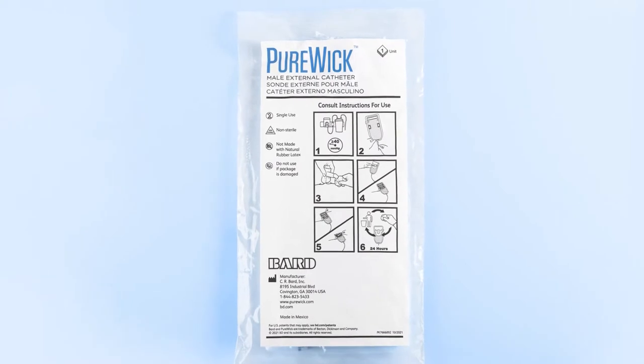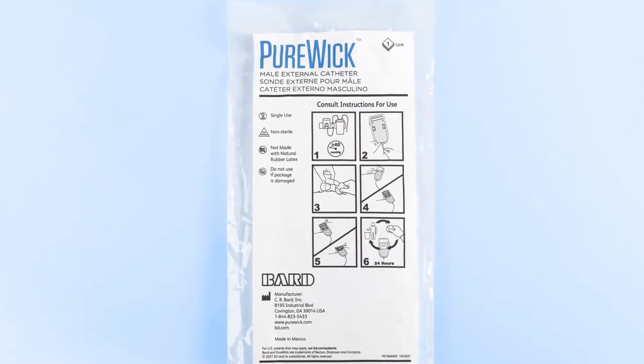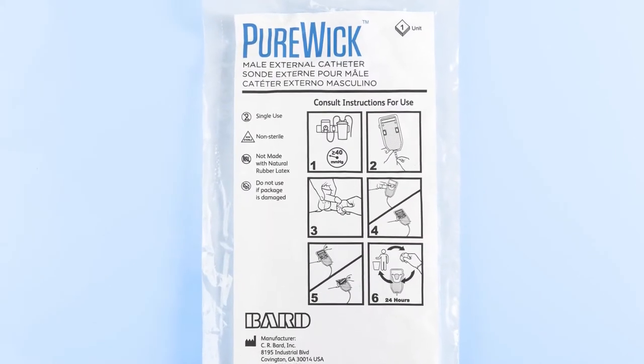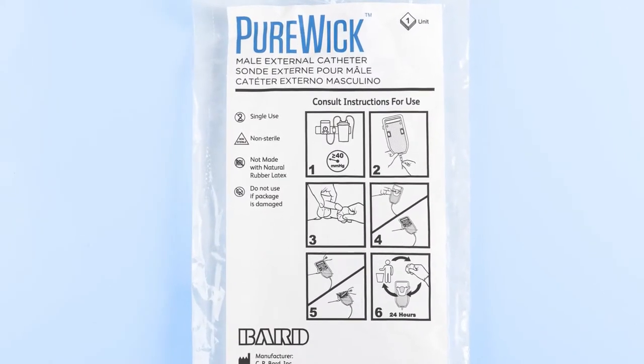Introduction: The PureWick male external catheter kit is intended for non-invasive urine management for male patients. It is designed to promote early catheter removal and lower CAUTI risk.